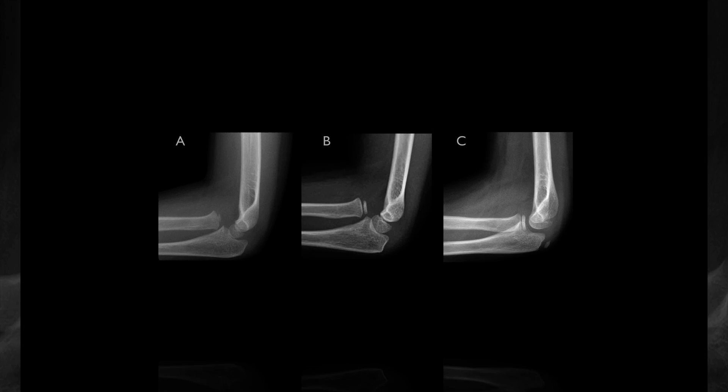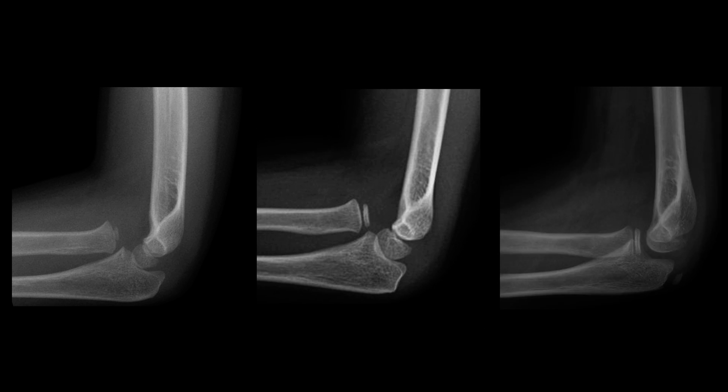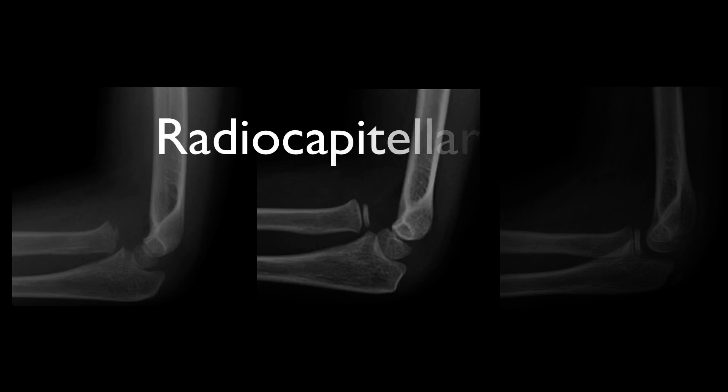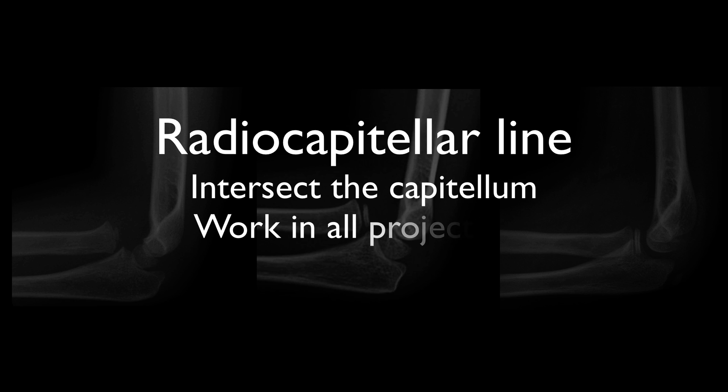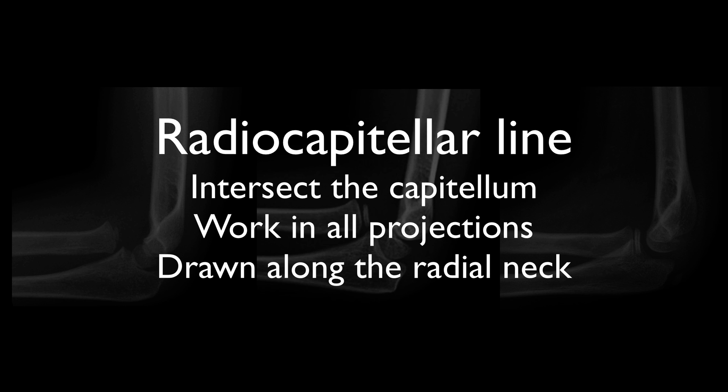So we've looked at all three cases and seen two of them have radial head dislocation. We've learnt that the radiocapitellar line is key to assessment of elbow alignment, that it should intersect the capitellum in any projection, and that it should be drawn along the neck of the radius, not the shaft.